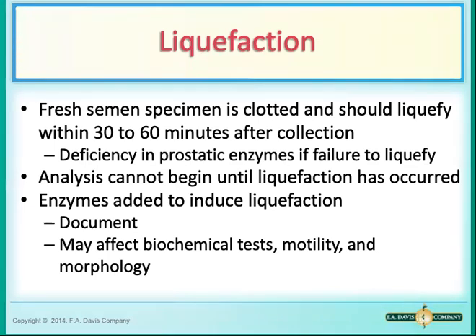Or sometimes what we do is we add proteolytic enzymes such as alpha chymotrypsin or bromelain to induce liquefaction and allow the rest of the analysis to be performed. Okay, so when you do add these treatments, because these treatments could affect some biochemical tests, sperm motility, maybe even the morphology, you have to document the addition of these treatments.